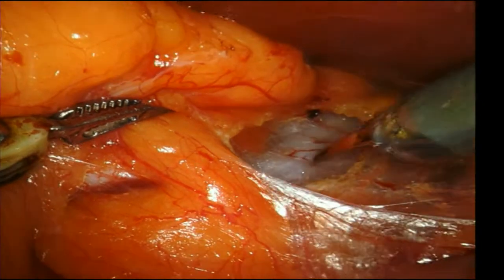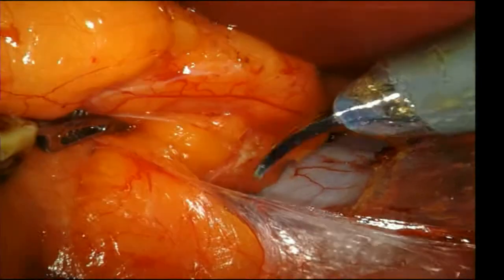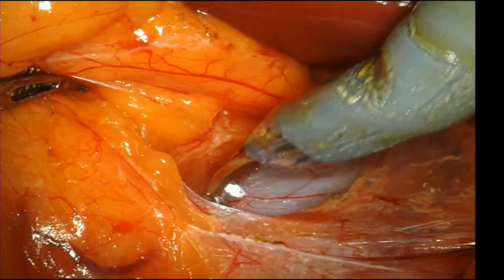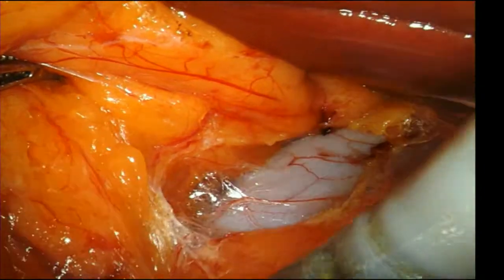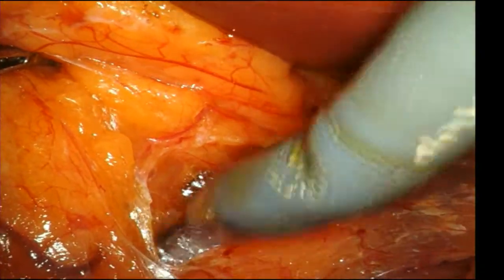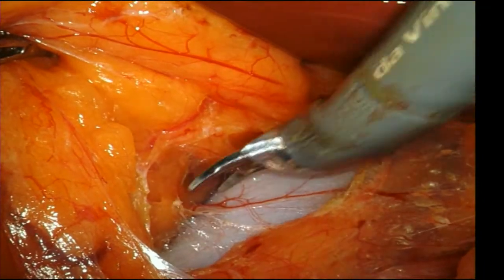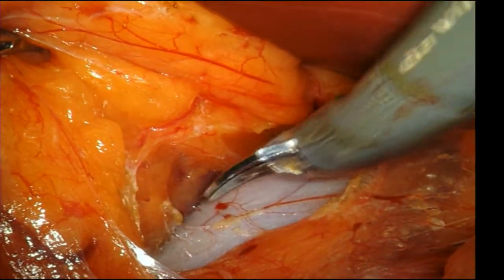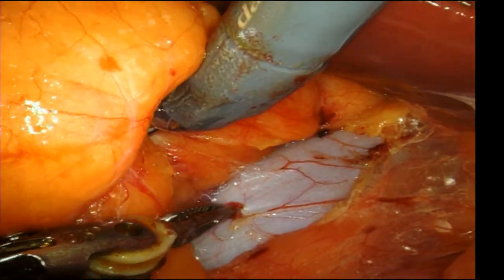So Ronnie, it's Clayton here. Just a quick question for the ports. Did you just do a straight line on this one, or what was your port configuration for the three ports? When the Xi robot came out, they told us you can do straight line ports and go lateral with your ports. I didn't change what I was doing with the previous robots. I still use my standard four-port configuration.